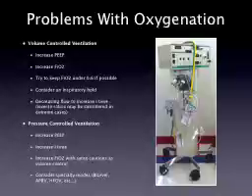Clearly, this can lead to lots of problems, such as auto PEEP, hypercapnia, elevated CO2, ventilation problems, respiratory acidosis. So I need to be very careful if I do inverse ratio ventilation, and I'll probably talk about that a little later on, since it is a specialized mode. And generally, it occurs in pressure control.